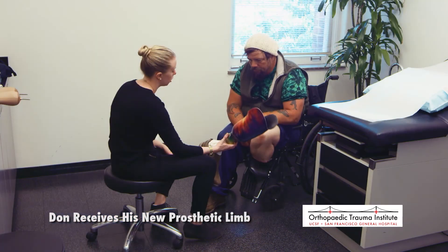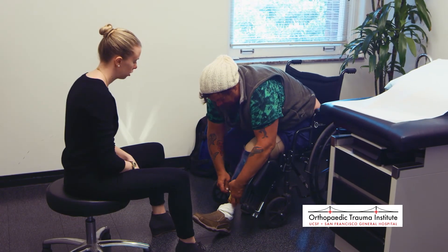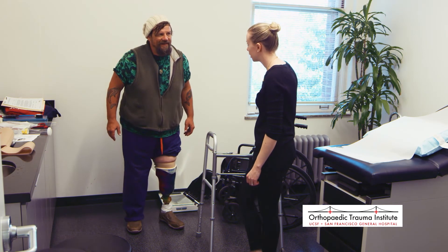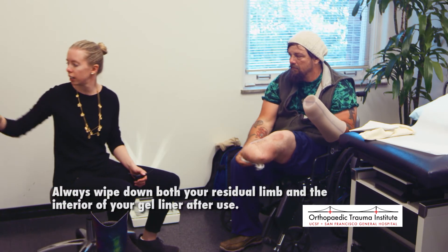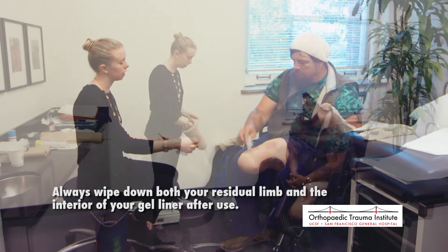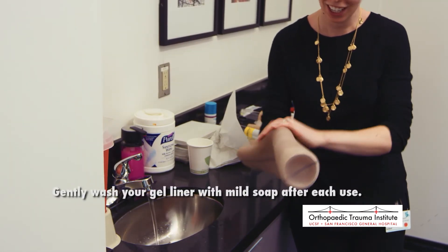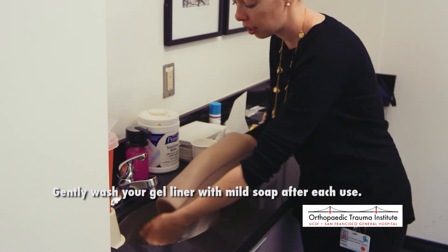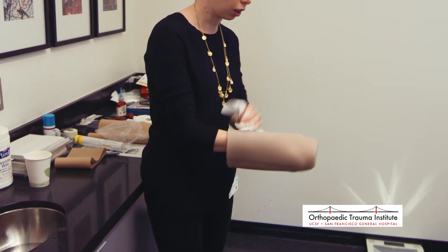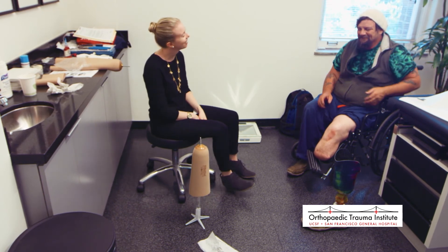After a handful of visits and about five months after losing his foot, the day has come for Don to receive his finished prosthetic limb. Hannah takes time to explain the needed maintenance: wipe down both the residual limb and the interior of the gel liner after removing it. At the end of the day, turn the gel liner inside out and wash it gently with water and hand soap only — never dish soap or anything stronger, as it can damage the liner. After washing, dry gently and hang it on the rack or on its side. With proper maintenance, the gel liner should last about six months.